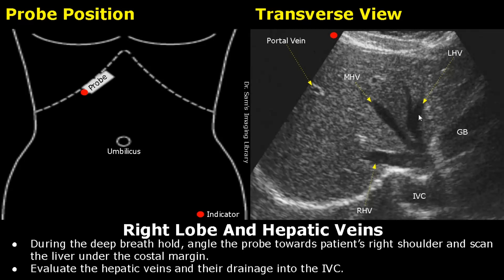This is the left hepatic vein — it will always be in the right half of the image. This is the middle hepatic vein. And this is the right hepatic vein — it will always be in the left half of the image. All three veins are draining into the IVC. These are the portal veins with hyperechoic borders. The gallbladder is seen here.